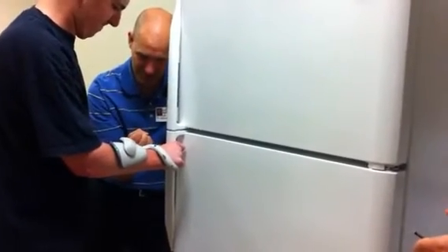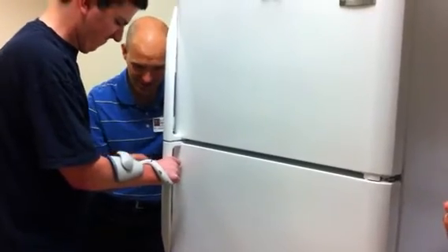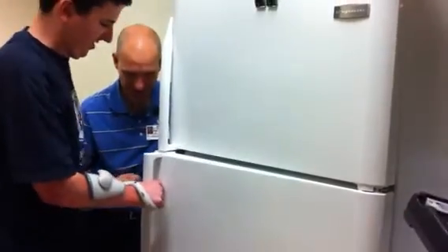Close. Use your muscles. Squeeze, squeeze, squeeze. It's turning on. Pull. Alright!